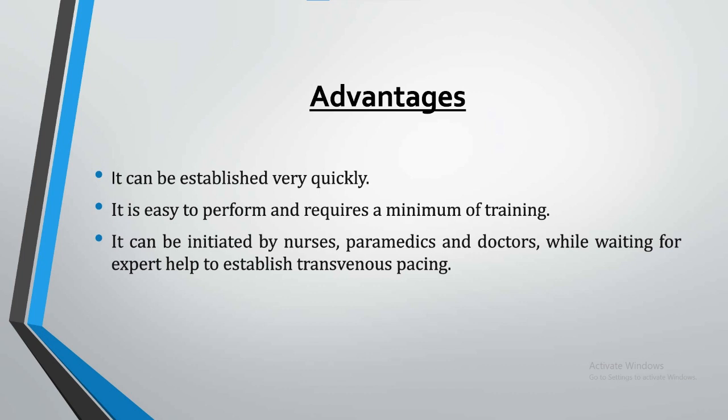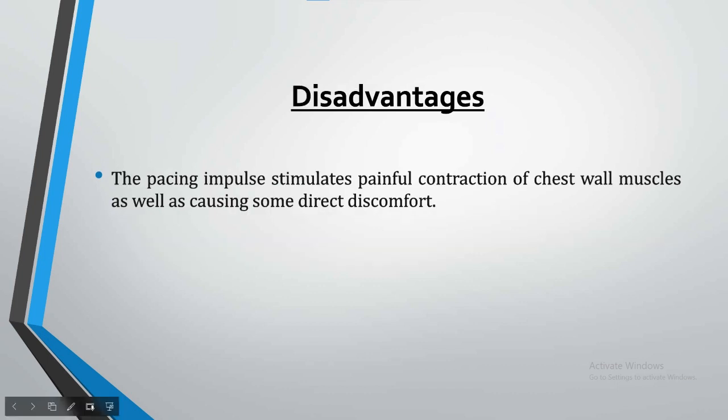It is easy to perform and requires a minimum of training. It can be initiated by nurses, paramedics, and doctors while waiting for expert help to establish transvenous pacing. Disadvantages. The pacing impulse stimulates painful contraction of chest wall muscles as well as causing some direct discomfort.